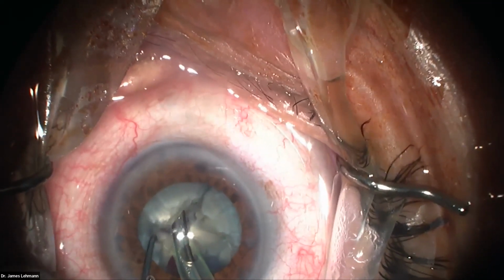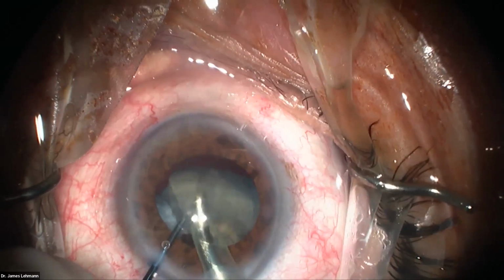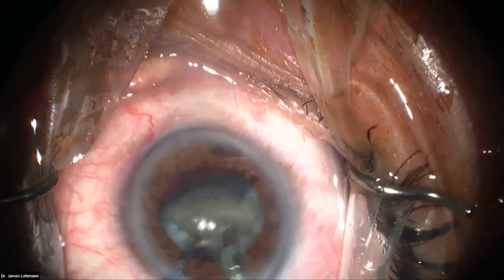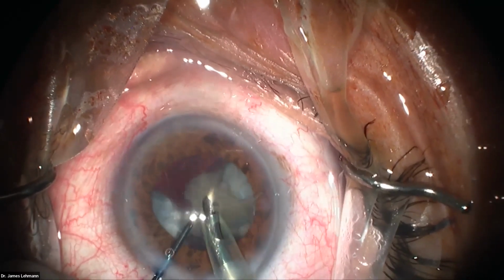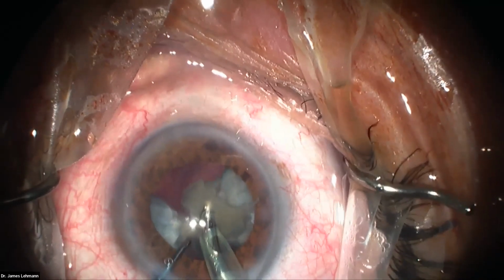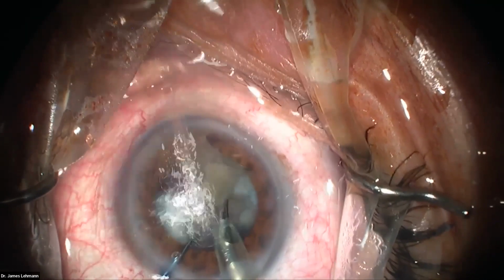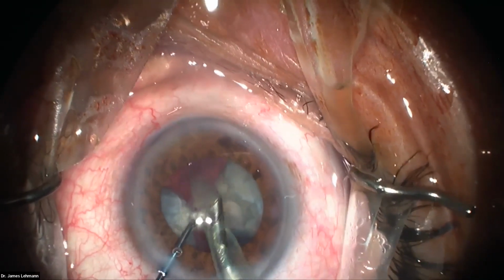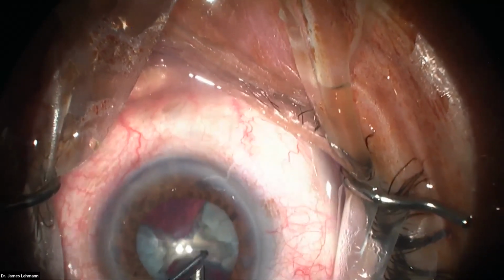Okay, peristaltic quadrant still. All right, now I'm going to bring this guy up. So they may be attached down at the very base of the cataract. And see how I'm not really moving the tip much? Even my second instrument, I don't have to move too much, but I use my second instrument. I'm kind of stuck in this position. I'm going to push the piece away again and then come back to it with my phaco tip. And I'm just doing a medium amount of power here. I'm not flooring it. I don't want to see too much movement, too much stuff happening.